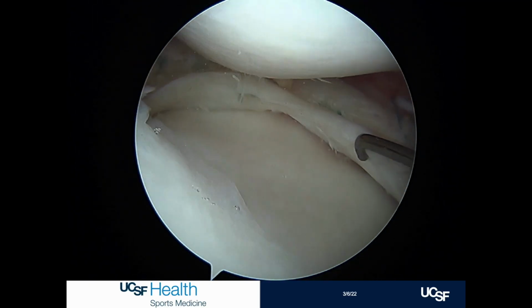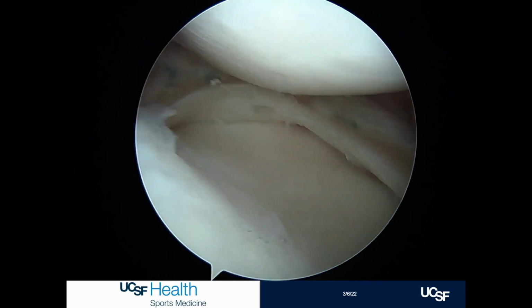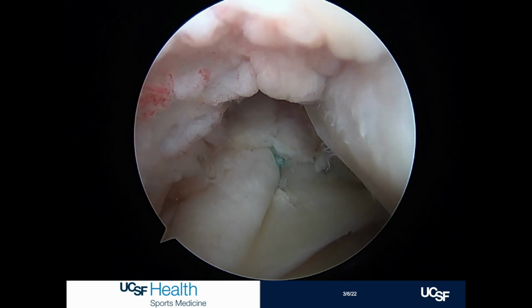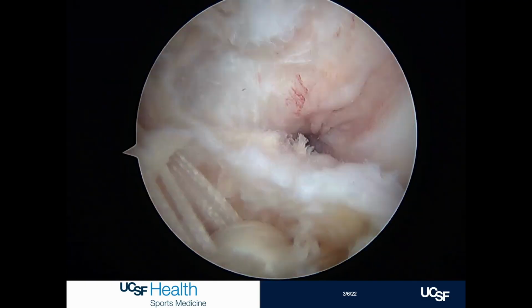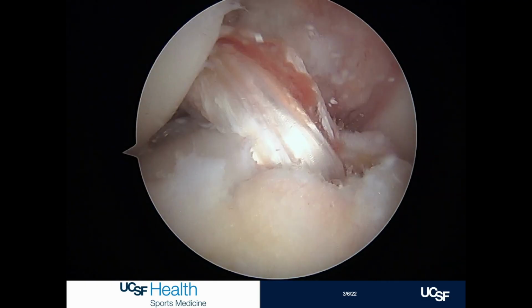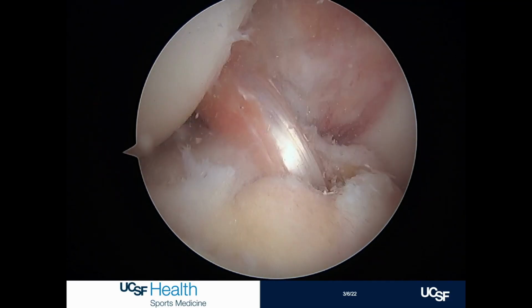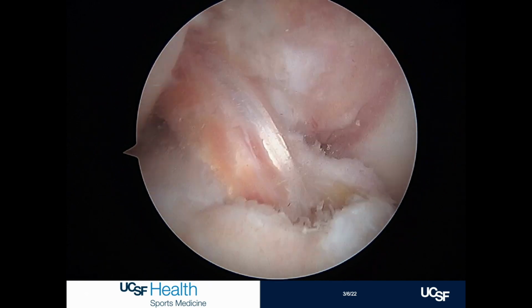You can see the cartilage surfaces here are really good, so I'm optimistic this patient will do really well. We typically, when we do meniscus repairs, use a microfracture awl, but in this case we're doing an ACL reconstruction, so we didn't feel we needed to do a microfracture for growth factors for this particular patient.